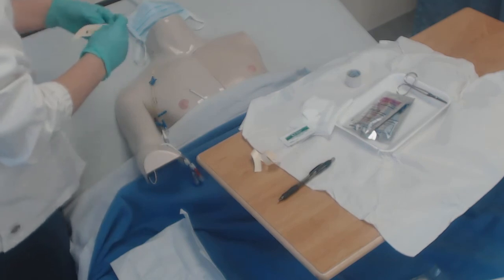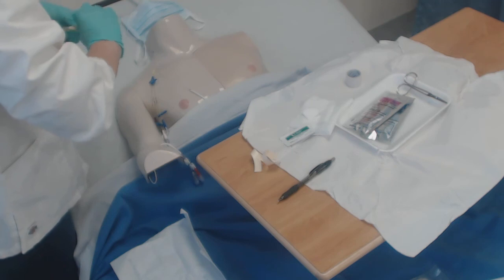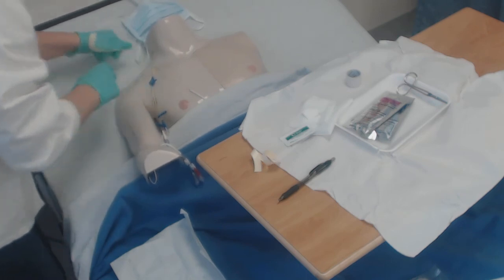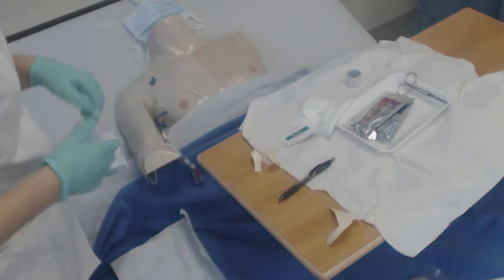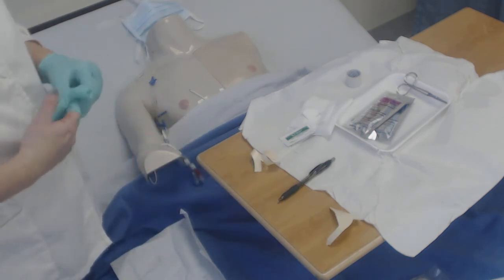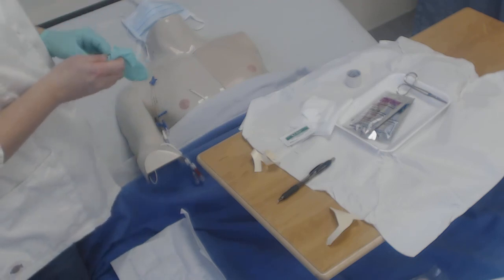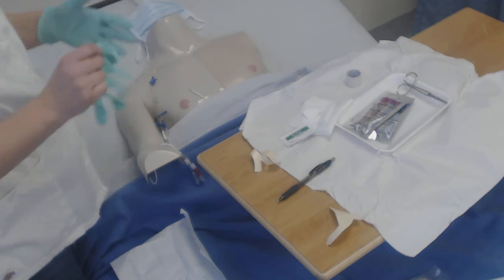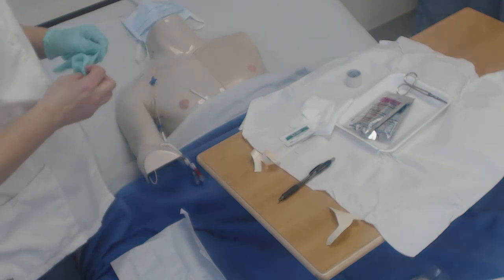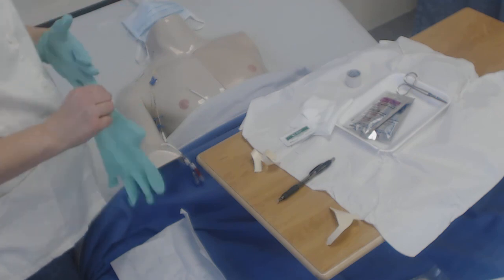You're going to date, time, and initial the dressing. Dispose of your equipment and document how the patient tolerated the procedure and anything out of the ordinary. This would also be the time, if it was the day to change them, to change the caps on the lumens. That's it.